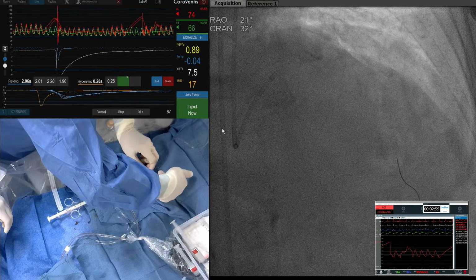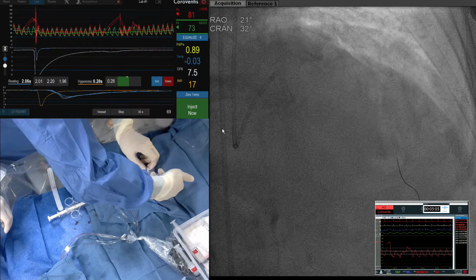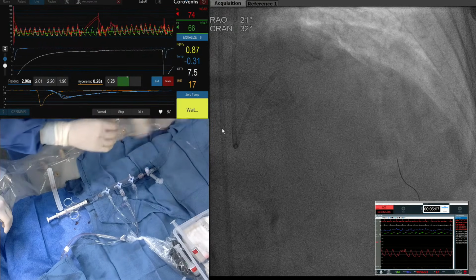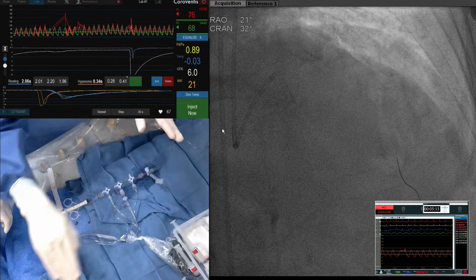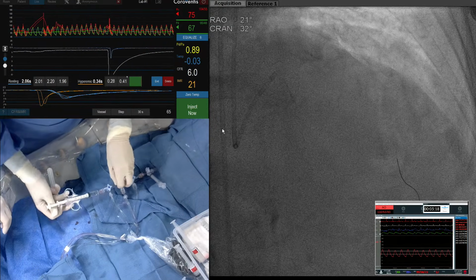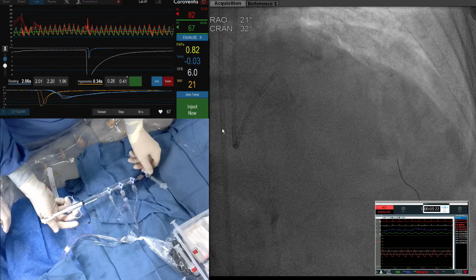Again, I wait for the temperature to get back to close to 0 before I re-inject, and we're pretty much there. And we have adenosine running. But you see that nice sharp dagger versus our resting, which was more of a hump, like a thermodilutional cardiac output. That really speaks to the augmentation that her coronaries are seeing here.